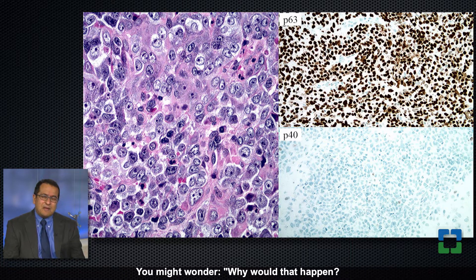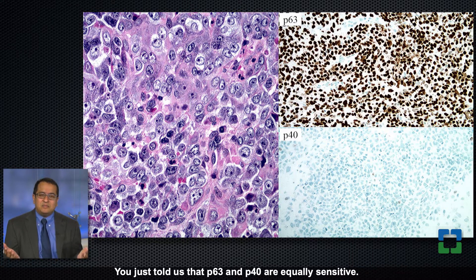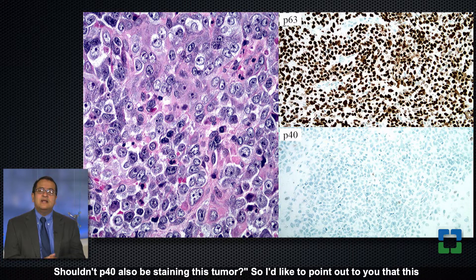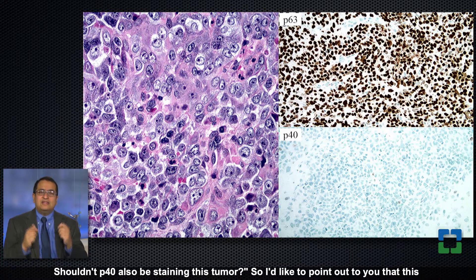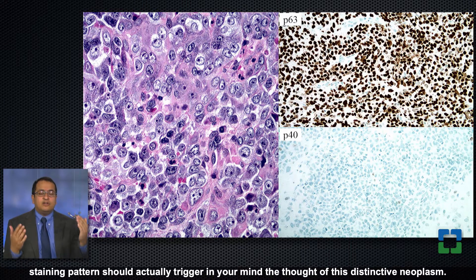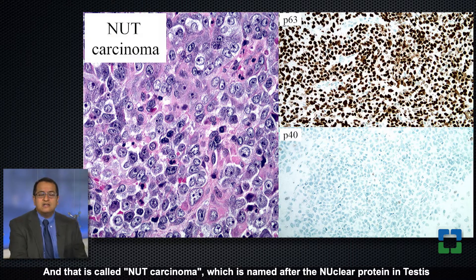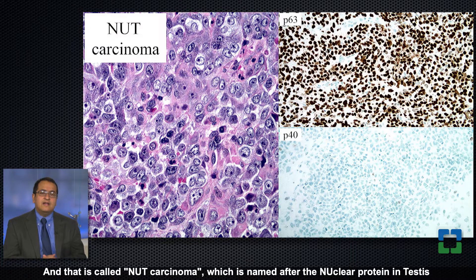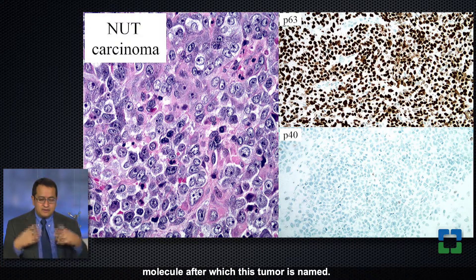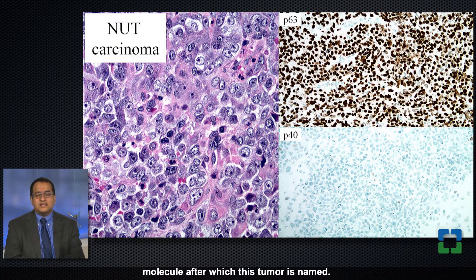You might wonder why that would happen — you just told us that p63 and p40 are equally sensitive, so shouldn't p40 also be staining this tumor? I'd like to point out that this staining pattern should actually trigger in your mind the thought of this distinctive neoplasm, which is called NUT carcinoma, named after the nuclear protein in testis molecule.